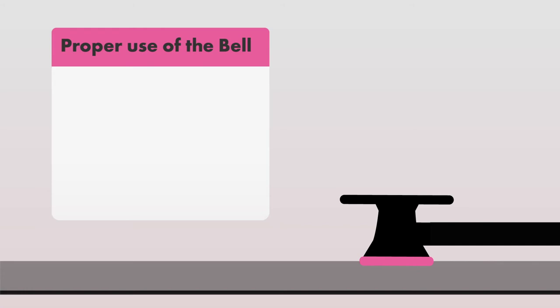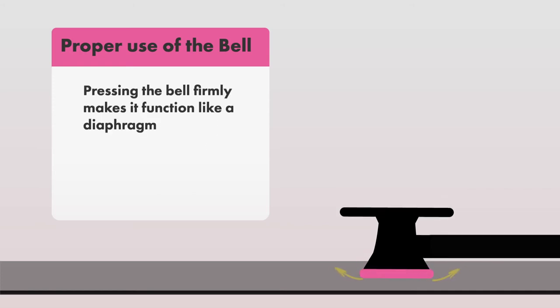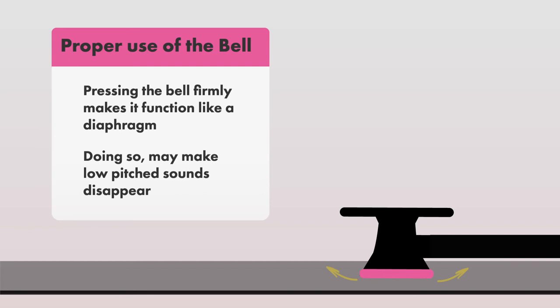Classically, when listening for heart sounds with the bell of your stethoscope, it should be placed lightly on your patient's chest or other auscultatory areas. This means placing the bell on your surface with just enough pressure to produce an air seal. This is important because pressing the bell firmly on your patient's chest or other auscultatory surfaces makes it function more like a diaphragm by stretching the underlying skin. Doing this may make low-pitched sounds such as S3 and S4 disappear when listening with the bell.